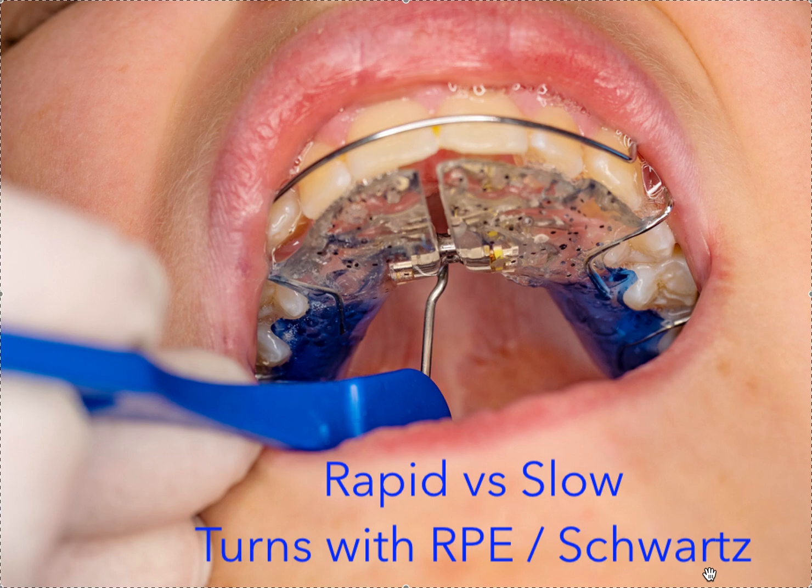I can't tell you how much scary stuff I've seen happen with expanders, and I don't want to freak you out, because most of this happened either because the frequency was wrong, they overcranked it, they didn't wear it consistently and tried to shove it in, or they kept turning when they weren't supposed to and didn't come in for follow-ups. And these were not my patients. They were other doctors' patients, and I either subbed in their office, or I filled in, or they were train wrecks, and they got sent to me because I knew how to handle it, how to fix it. I was a fixer. But I've seen scary stuff happen.